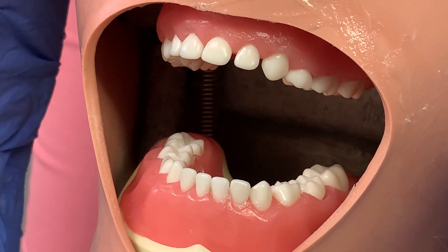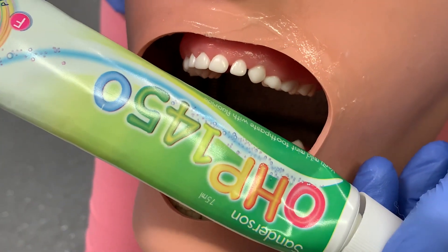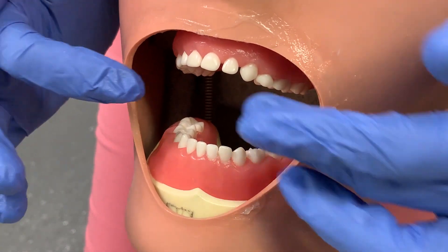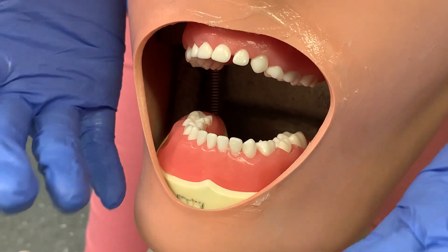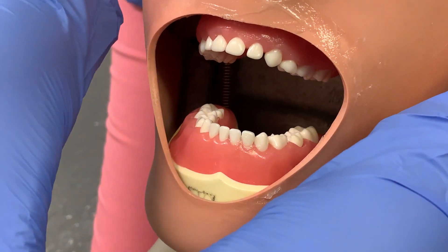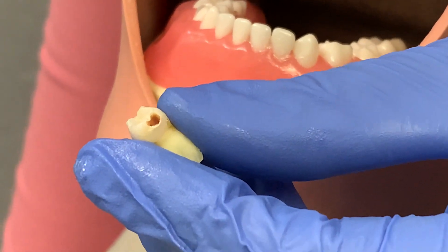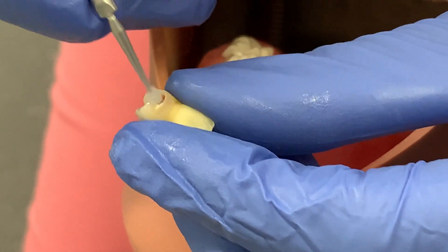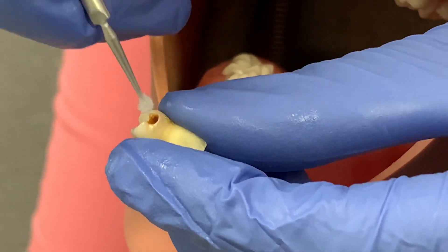It does have a bit of a metallic taste, so what you might want to do — and this is something we commonly do — is just put a bit of toothpaste on the child's tongue, a mild mint one. Alternatively, some people advocate putting fluoride varnish over the area you've just applied. It's up to you depending on your patient. I've got an extracted tooth here just to show the staining potential and how you'd apply it to a cavity.